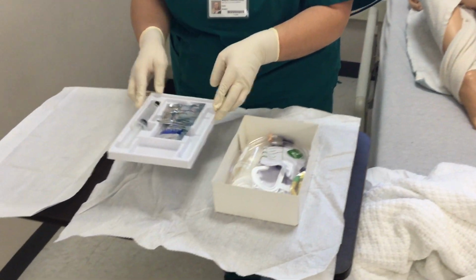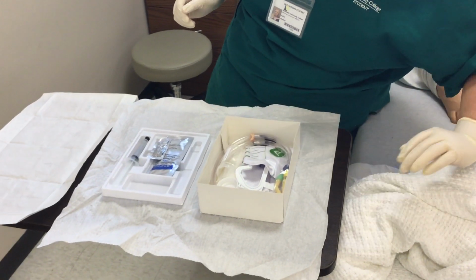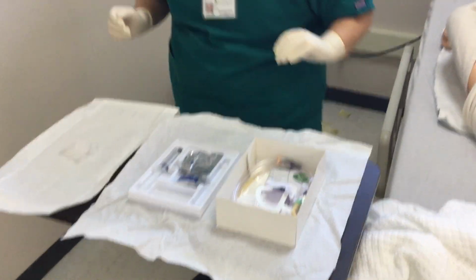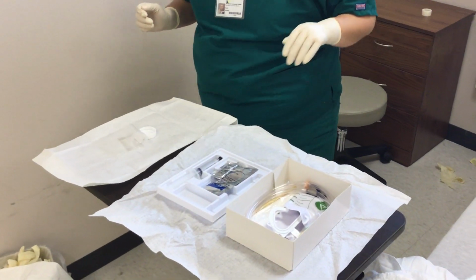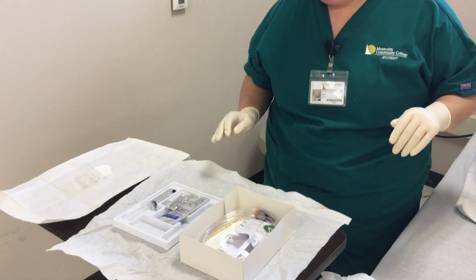I'm going to provide care to them, rinse, wash, rinse, and dry. And I want to also check for any erythema, drainage, odor that could be present. Then I want to take my gloves off and apply hand hygiene.